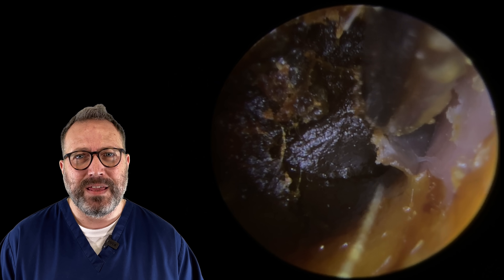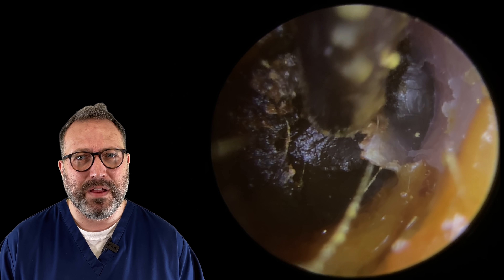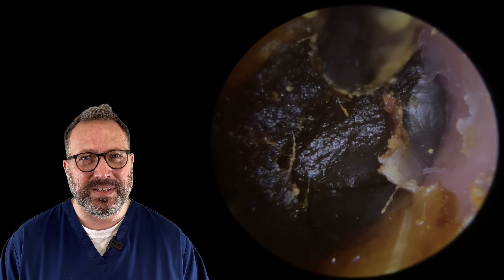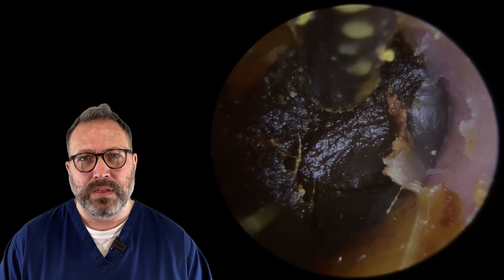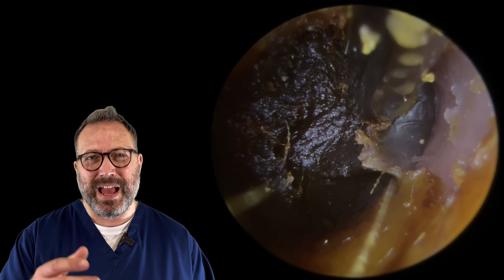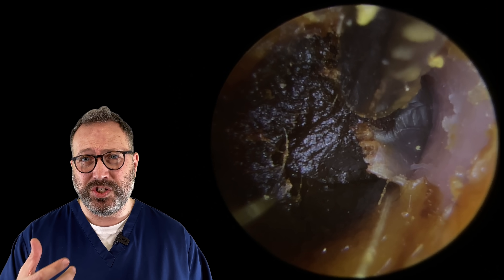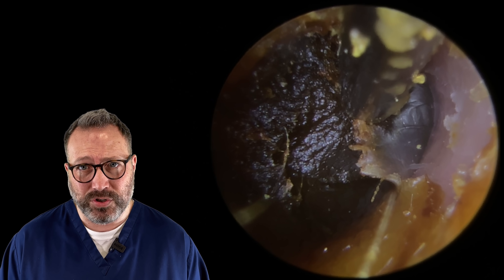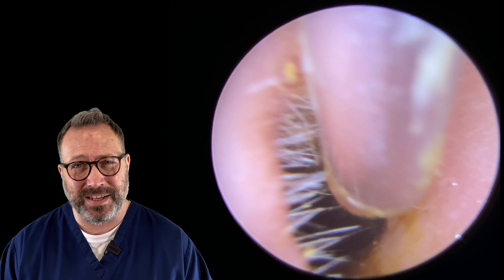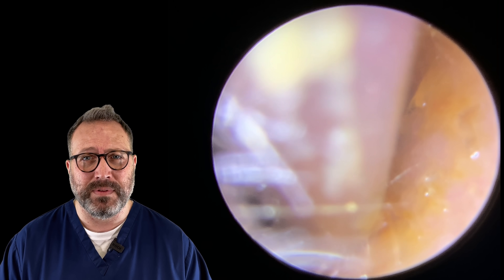Just aiming and teasing off that top right corner but you can see it's not really budging, so we're going to carry on with this peel. There's a little loose bit to the top left but it didn't really come to anything, and centrally it's not really budging either. You can see how difficult and how blocked up this patient would have felt, because there's just no gap in that wax at all - it's completely covered the eardrum and it's sticky, stuck to the canal walls themselves.